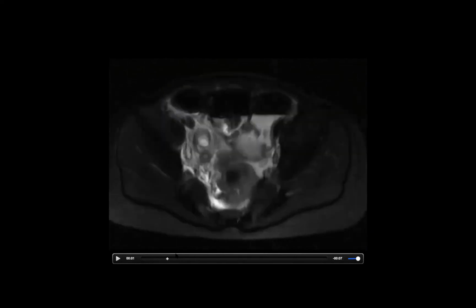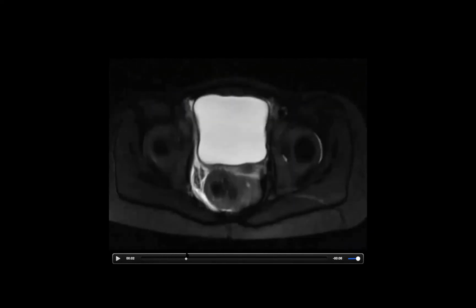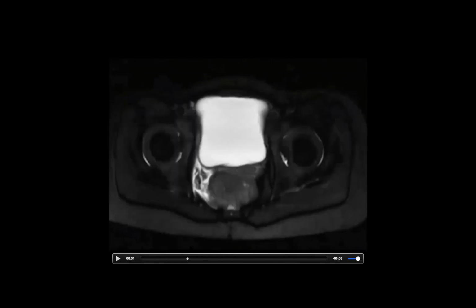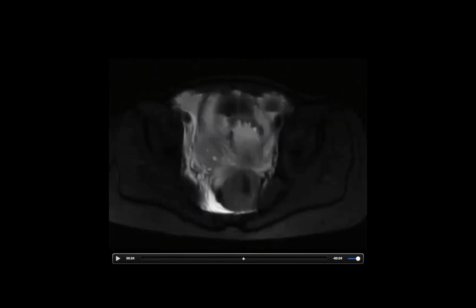So you can get a good sense here. And actually, I do ask our technologists to have somebody urinate before getting on this table. But here you can see they probably didn't. So the urinary bladder is quite full. So sometimes that puts a constraint on how long we can scan these patients.